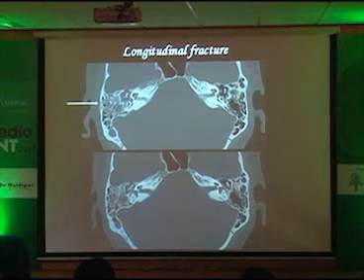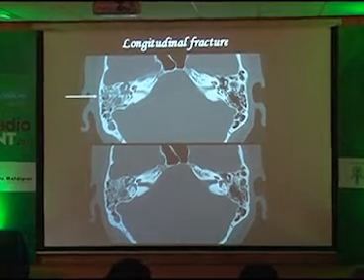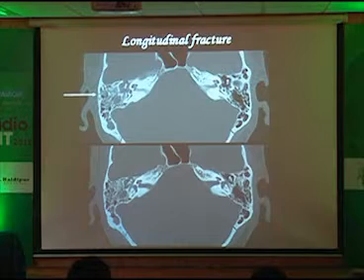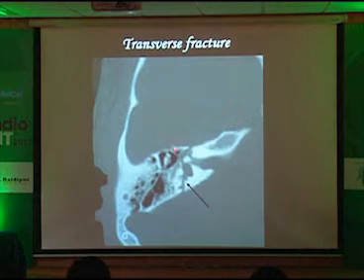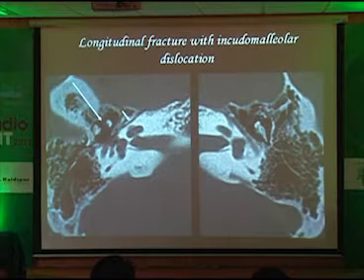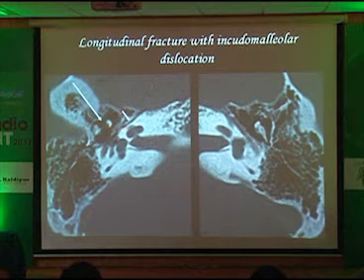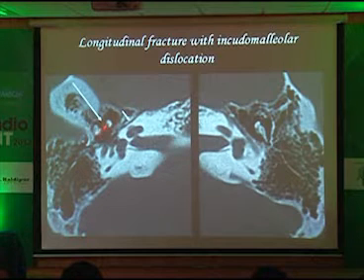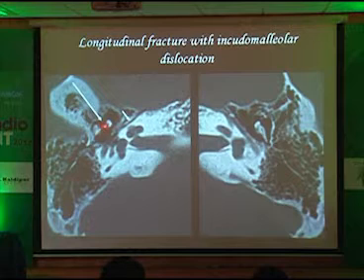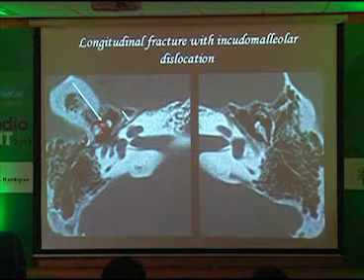Trauma: there are two types of fractures — longitudinal and transverse. If a fracture occurs along the plane of the petrous temporal bone, it is longitudinal; if perpendicular to it, it is transverse. If the fracture goes through the facial canal, it can involve the facial nerve. This patient had an incudomalleolar dislocation — classical ice cream cone on the left, with separation of the joint post-traumatically.